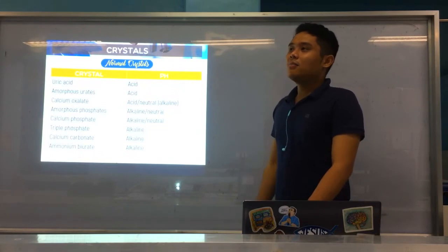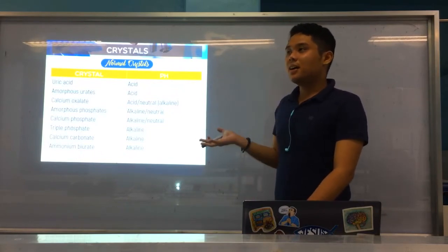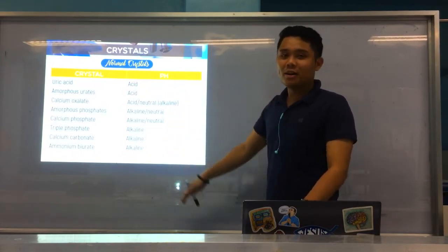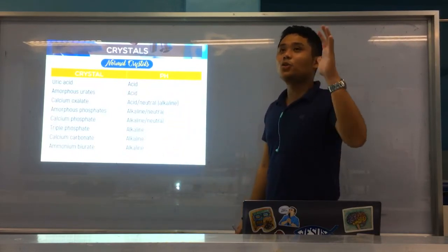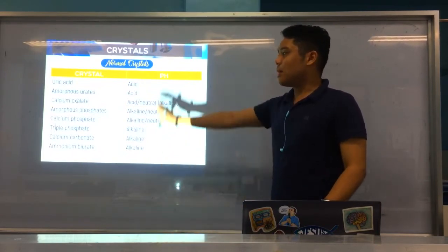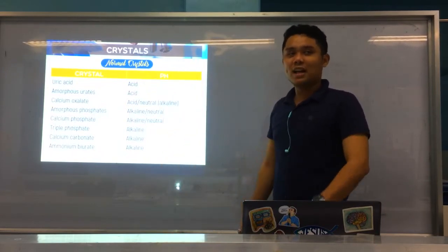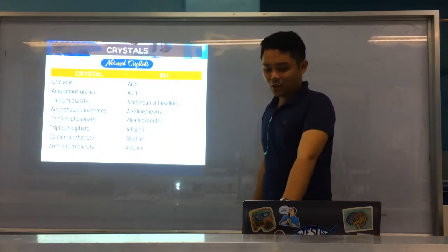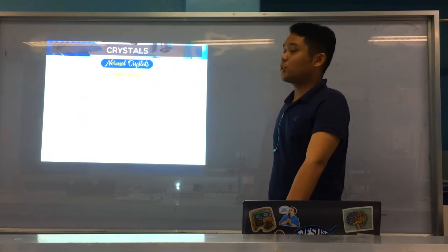As you can see, in my way of remembering which urine is acidic or alkaline, I remember my Gen Chem: carbonates and phosphates, I tend to look at them as basic, so they are found in alkaline urine. And then acids, urates, uric, those are acidic, usually found in acidic urine. Okay? Alright, so we'll start first with the normal crystals. First one is uric acid.